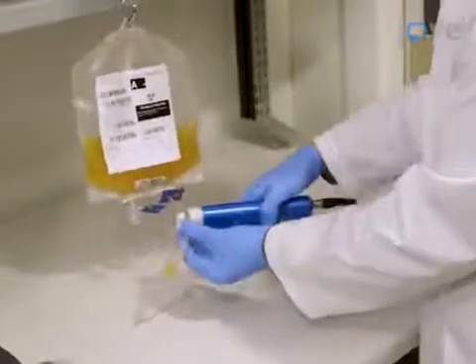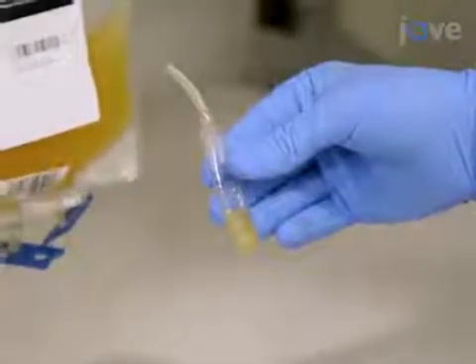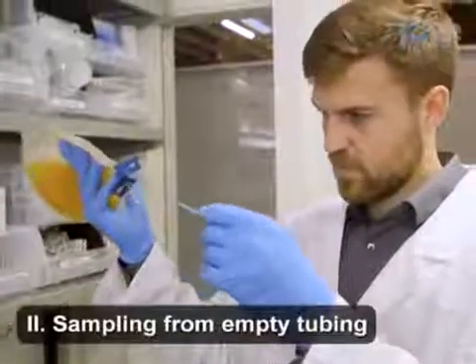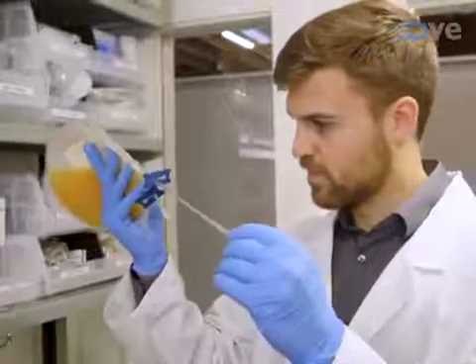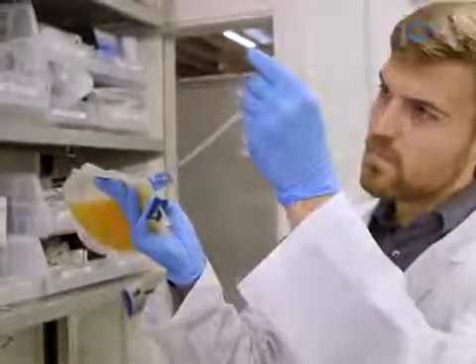Disconnect the pouch from the bag by heat sealing the connecting tubing with a tube sealer. When sampling from empty tubing, verify that the platelet bag tubing has been stored empty and that the tubing block is still in place. Visually inspect the tubing.